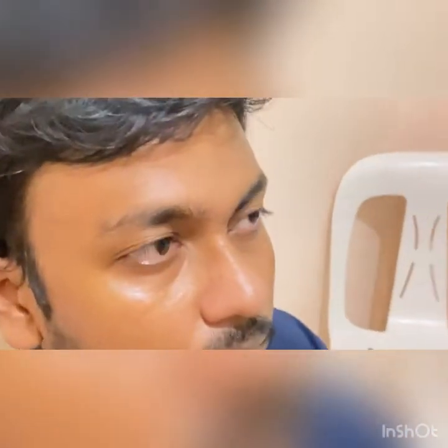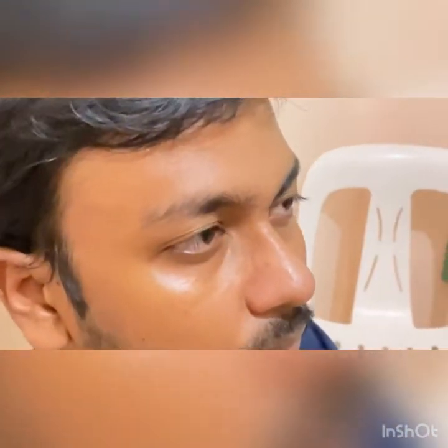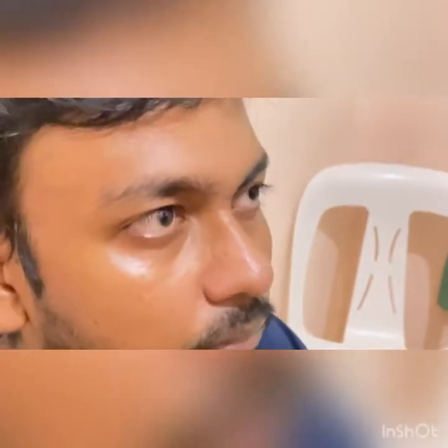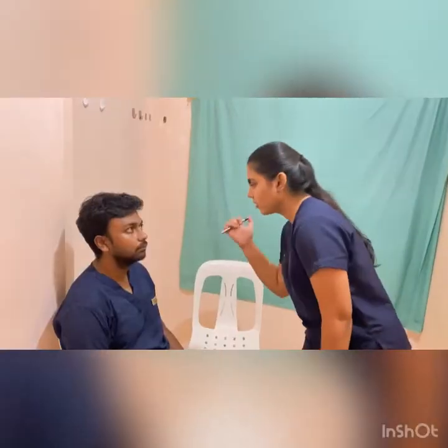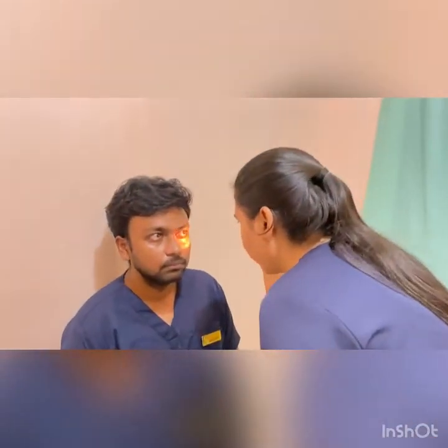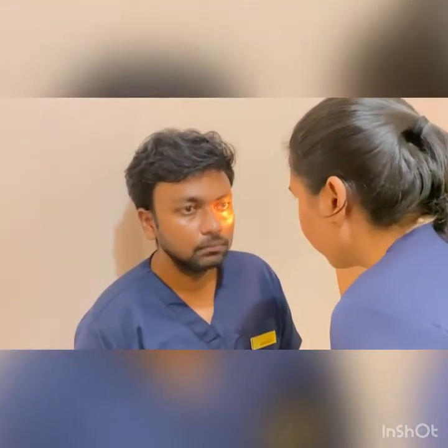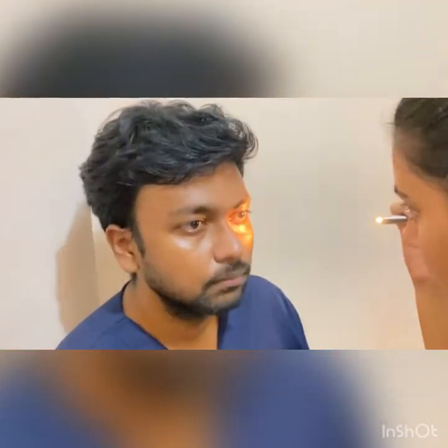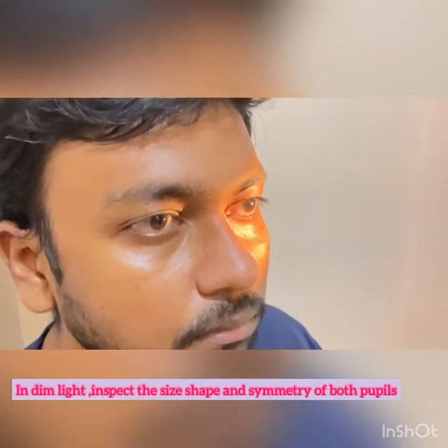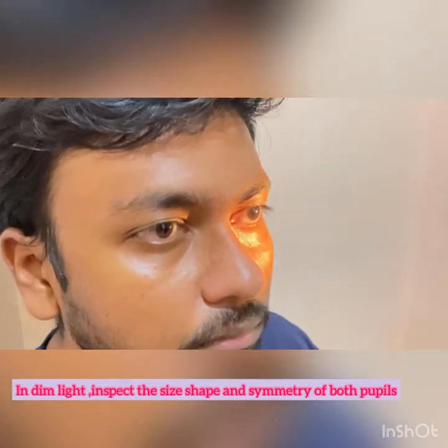Now we'll check the iris. Can you look into my eyes? Yes. The iris and the pupil are also intact. The markings of the iris should be clearly defined. Shining a light directly from the temporal side, look for a crescenting shadow on the medial side of the iris. There is none. Also, the size of the pupil is 2 to 5 mm.